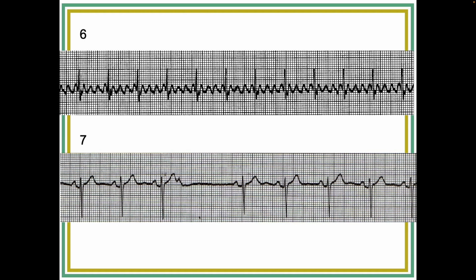That looks regular, and the rate is a little more than 100. 150, yeah, over 100.